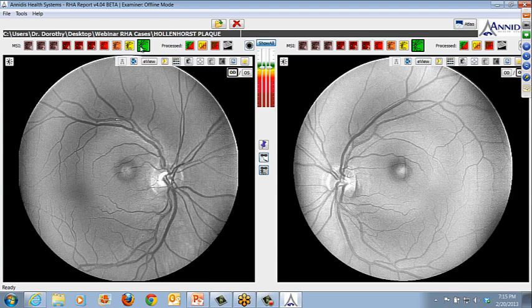And what I saw in her here, and again, greens and yellows are going to highlight and best define the retinal vasculature, and you can see it nicely highlighted here in the green. And remember, a Hollenhorst plaque. I think most of you would be able to identify that. Sometimes people have a little bit of difficulty differentiating what type of plaque there is. If you recall, a Hollenhorst plaque is hyperreflective. It will often look larger than the lumen of the retinal arteriole because it's more refractile.